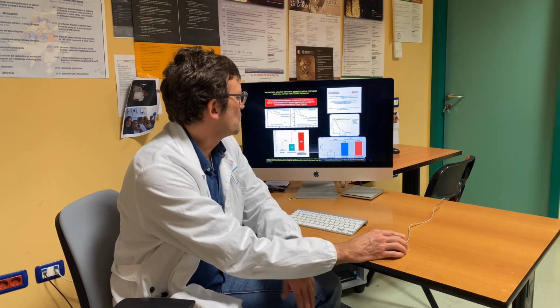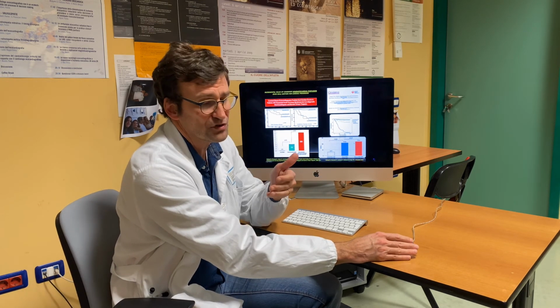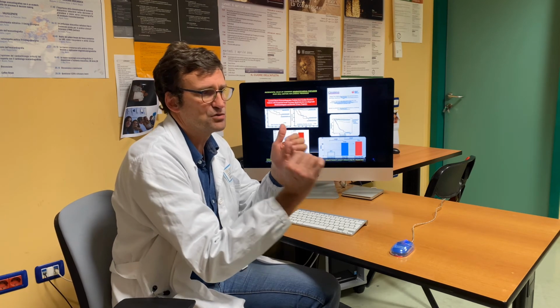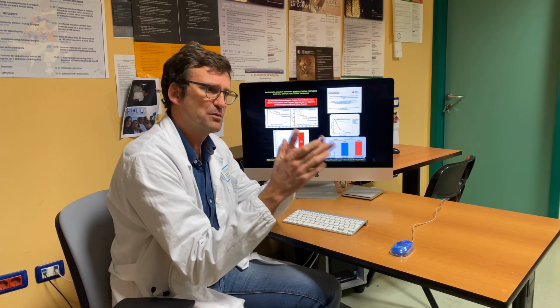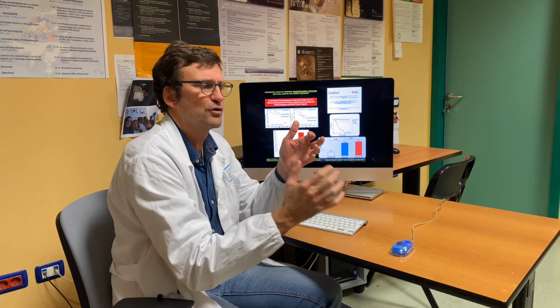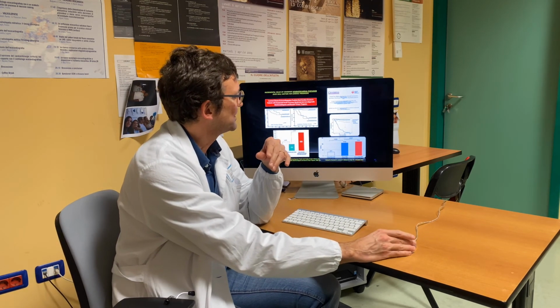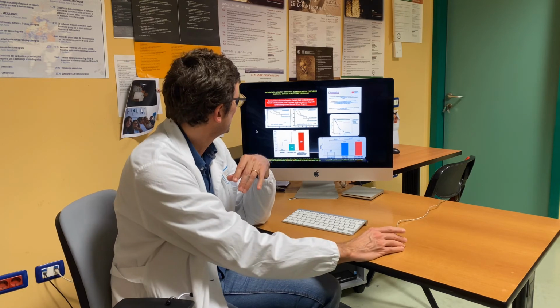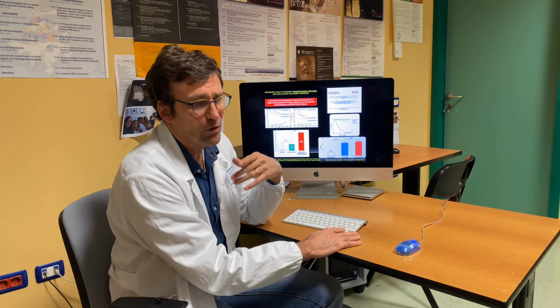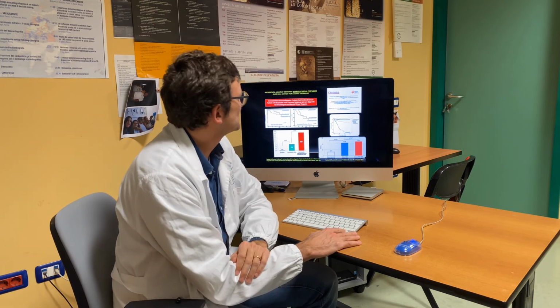So basically, when you study the accuracy in the prognostic setting, you see that perfusion and contrast in particular. So there is also demonstration that contrast helps when you just assess wall motion. So it's better than assessing wall motion without contrast. But if you're also able to assess perfusion, you will be capable to stratify much better your population. And this is in the acute setting from a group. This is in the what we now call chronic coronary syndrome setting.